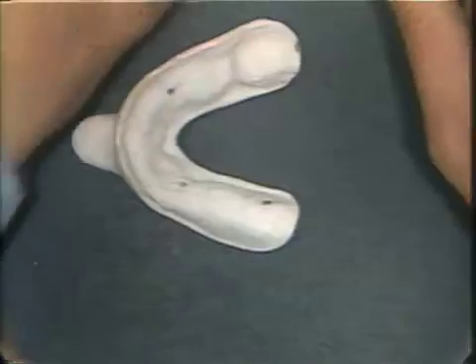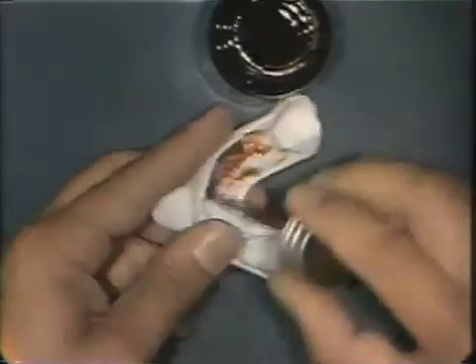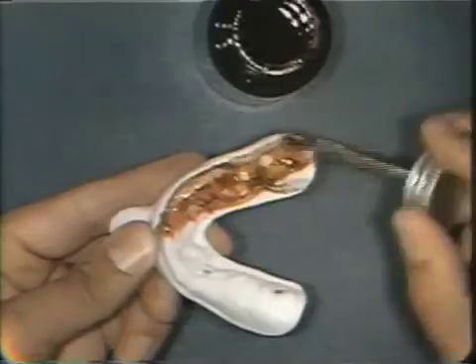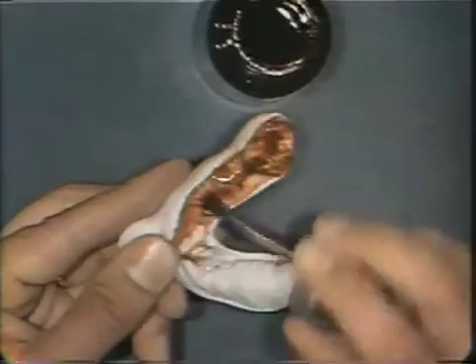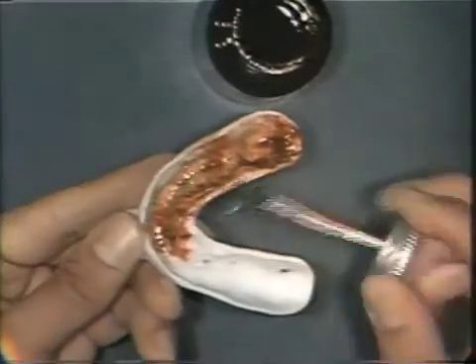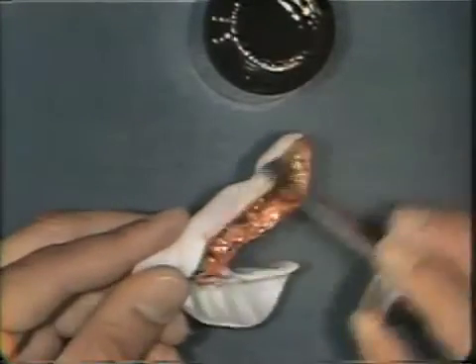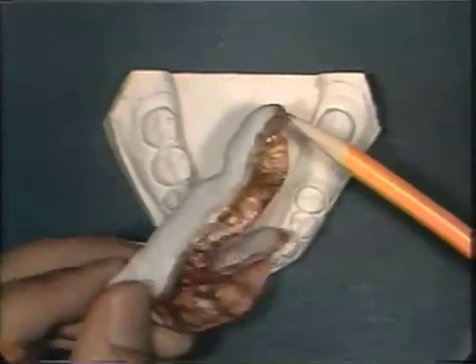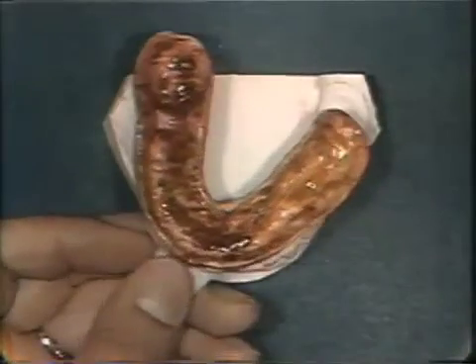A thin layer of permelastic adhesive is placed on the interior aspect of the tray. The material is placed over the periphery of the tray to allow proper adhesion of the rubber base to the tray. The tray is set aside after the application of the adhesive so that the adhesive will thoroughly dry. Once thoroughly dried with adhesive over the peripheries of the tray, you are ready to take the rubber base impression.